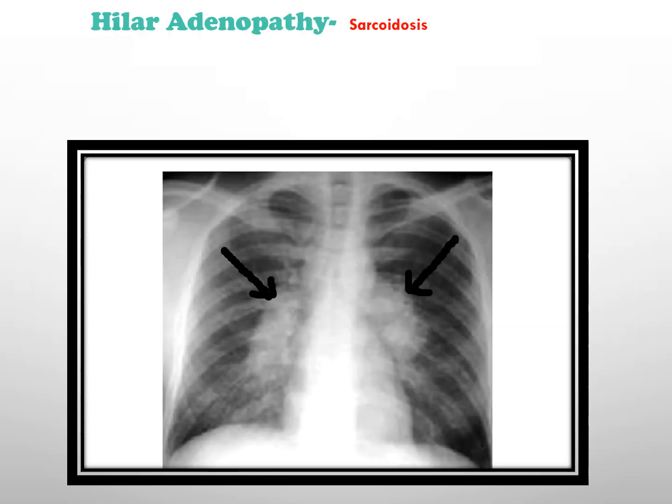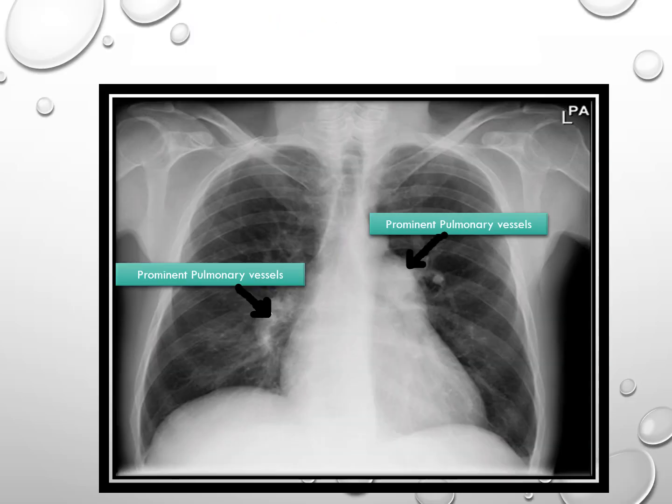This x-ray displays a predominantly nodular opacity pattern, particularly noticeable in the upper lung zones, with the possibility of accompanying hilar adenopathy, which is commonly seen in sarcoidosis.